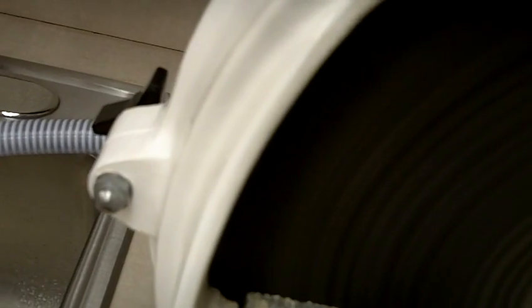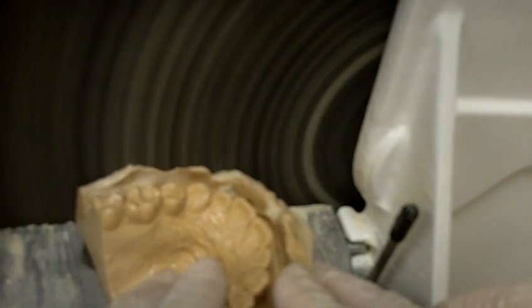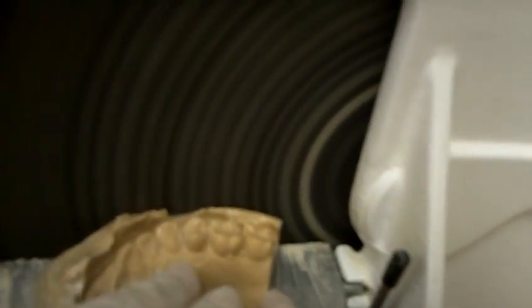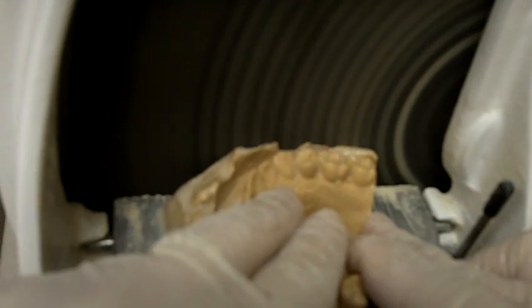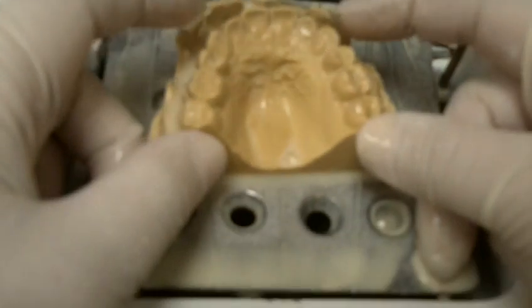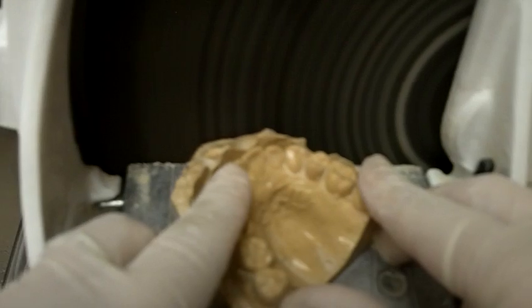Okay, now that I did the back, now I'm going to go to the side angle. Remember, it's going to be flared, and it's going to be from the, what is it? Middle of that canine is going to be flared out. So it's going to be flared out. I'm going to put more pressure towards the front to flare it out. Okay. Now I know that my points are going to need to be from the canine to the central. So I'll go from here to here, and this is why you want it marked.